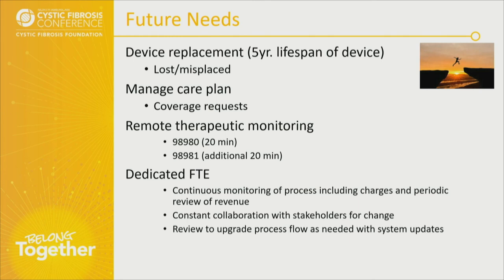So this includes a nurse. I specified this: a nurse, a respiratory therapist, as long as they have discussed it with a provider. So for instance, if your provider says, Dabney, I'm using her because she was the speaker in front of me, Dabney, I reviewed Laura's spirometry and it's down. Get her to do it again in 3 days. And if it's still down, then let's get antibiotics. And then let's see if she doesn't respond in 7 days and we'll need to admit.